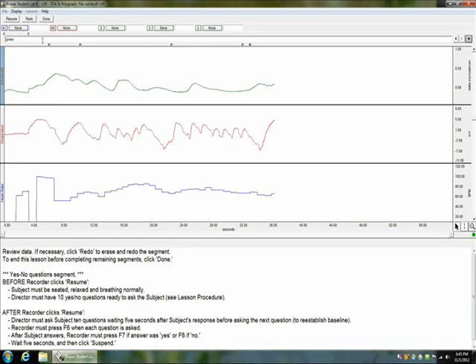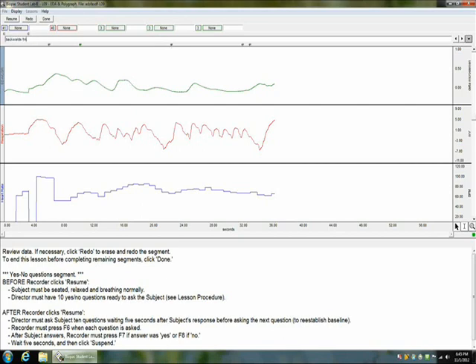So once our data is finished recording, we can hit suspend, and we can edit them in this white bar here. The markers shown is from the last added marker, so we can just edit it now. To get to the other markers, we will need to click on them, and then their labels will pop up in the white bar, and we can edit them as well. So we'll just go ahead here and make sure that all the rest of these markers are correct. And once they are, once we've verified them all, we can move on to our data analysis section.